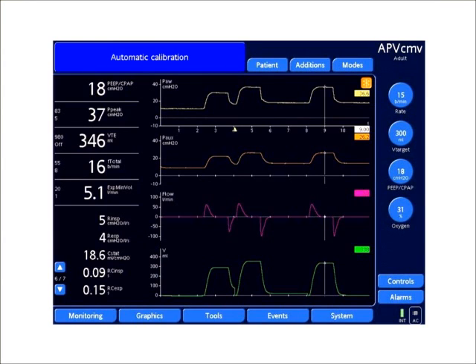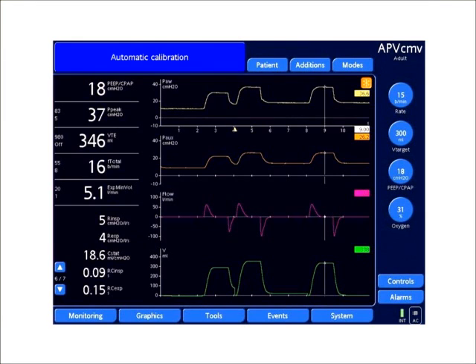This is titrating P-high based on esophageal manometry. When using airway pressure release ventilation, plateau pressure is commonly evaluated to identify the potential for lung injury, and you set your P-high based on the plateau pressure.